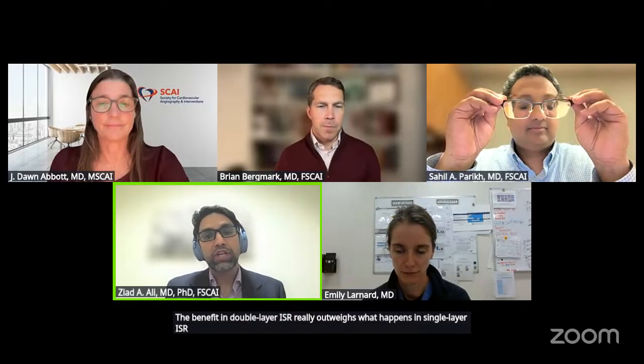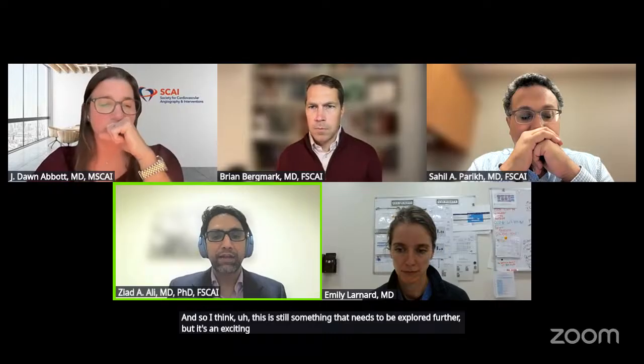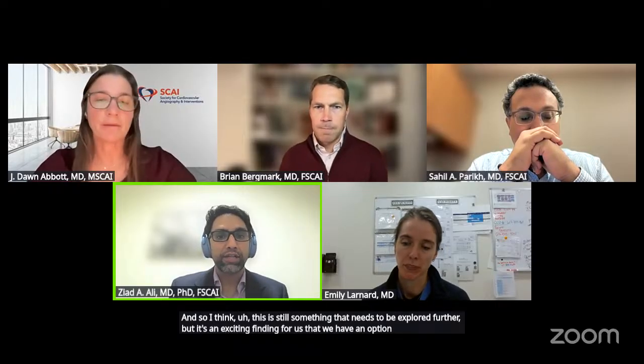And then of course the cost for double layer ISR of a third layer of stent, although there's very little data, seems to be appallingly bad. And so it gives us an option. And so I think this is still something that needs to be explored further, but it's an exciting finding for us that we have an option in double layer ISR with some good, reasonable efficacy.